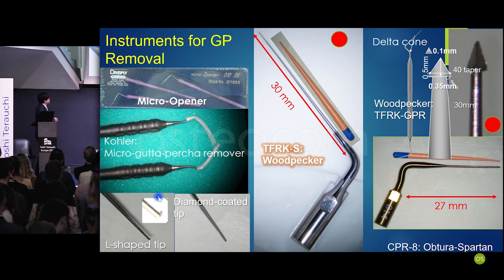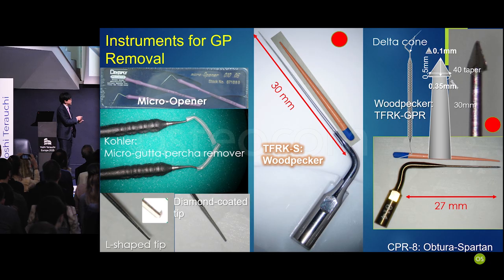So here you see the hook. This can be very good. If you see a hook on the instrument, you just press it against the root canal wall. Sometimes you can scrape the necrotic pulp tissues with a hand instrument, or you could use ultrasonics to remove calcified canals, calcified debris, and calcified necrotic pulp tissues.